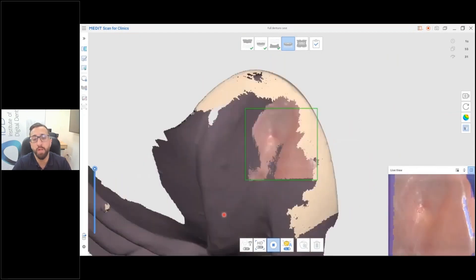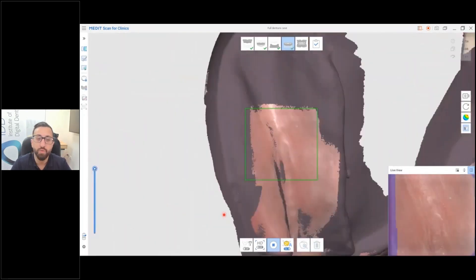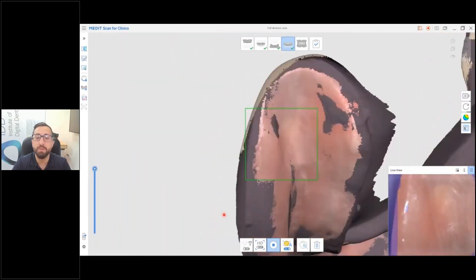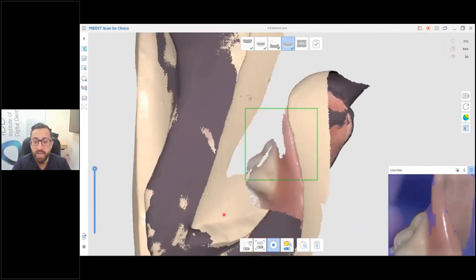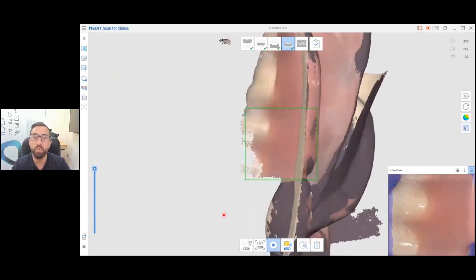The same workflow applies for the lower denture. Scan the fitting surface first, then rotate and start scanning the flanges. You can see automatically it has already aligned that with the model scan.